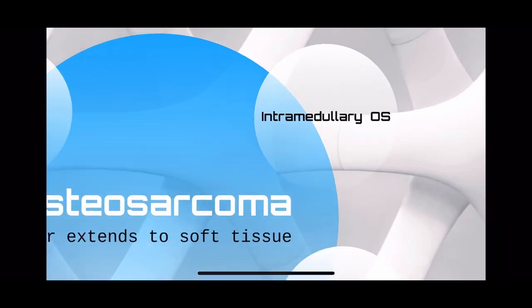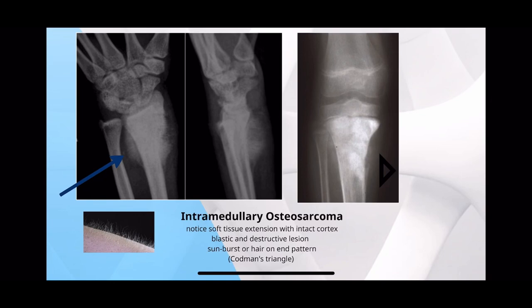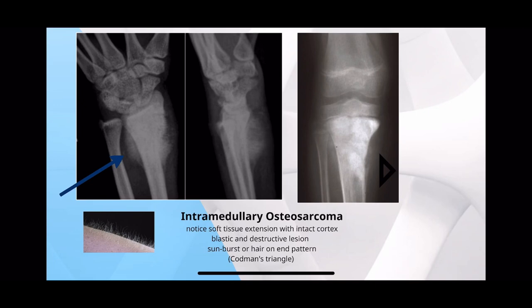In the intramedullary type — the most common osteosarcoma — you see a lesion from the medulla and cortex extending into the soft tissue, like a sunburst or hair-on-end pattern. You can also see the Codman triangle. All of this is seen in the metaphyseal or diaphyseal region. Very typical, hard to miss.